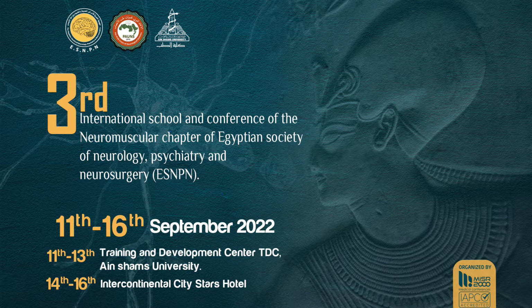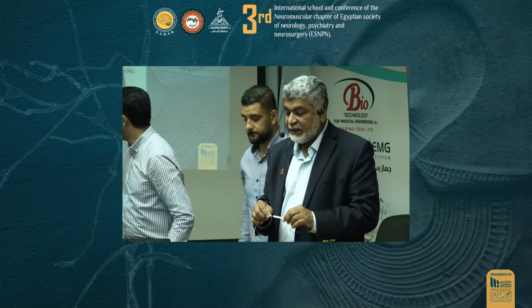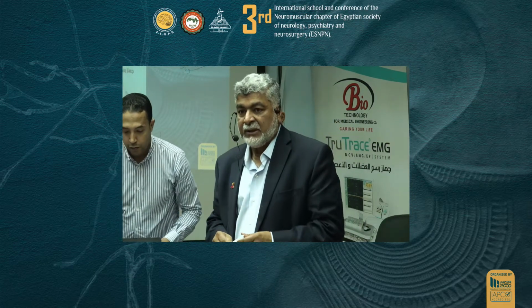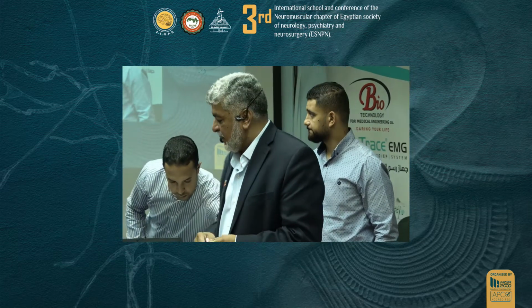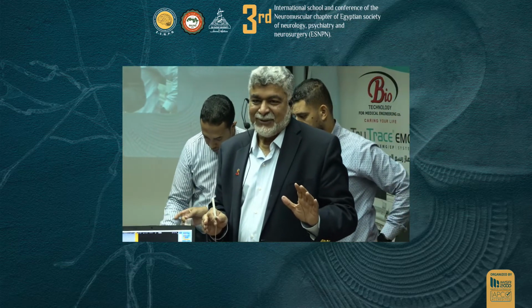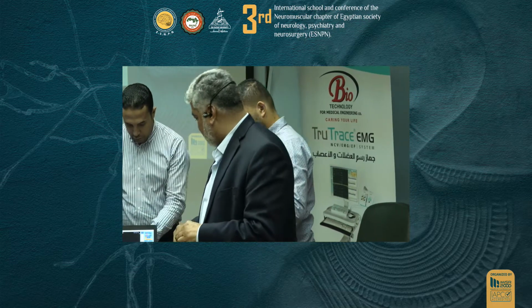I never reuse these needles, okay? There's a way to cap these needles back. You never cap it like this. Small things. You know how to cap the needle back? Medical, you better know this. You always go at an angle and then cap them. Never go otherwise, you poke yourself. You'll never poke yourself. Okay? But never reuse them. Clean the area well. Sterile technique, okay? But if you've done enough EMGs, you'll definitely poke yourself. If you've not poked yourself, you will one day. I've done it. You get worried, oh man, I got a disease, but it happens. Try your best not to, okay?